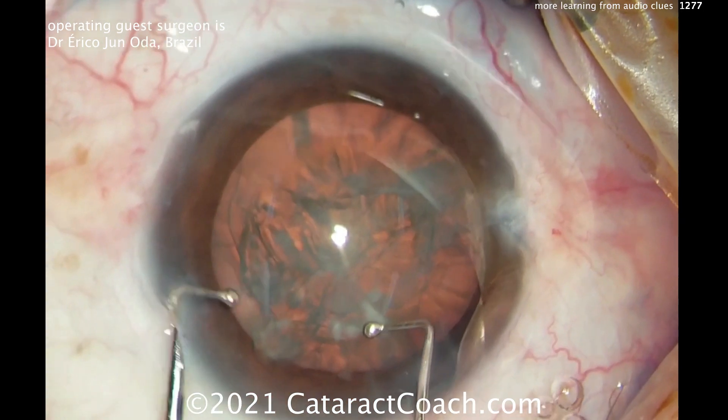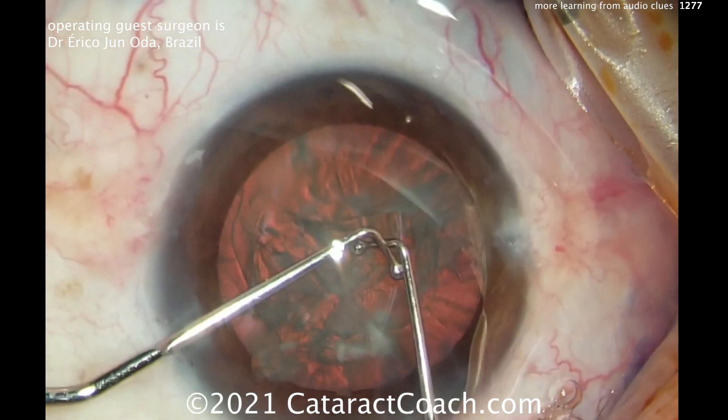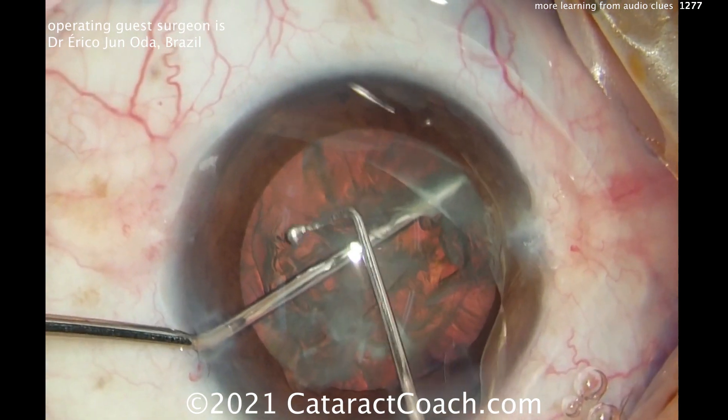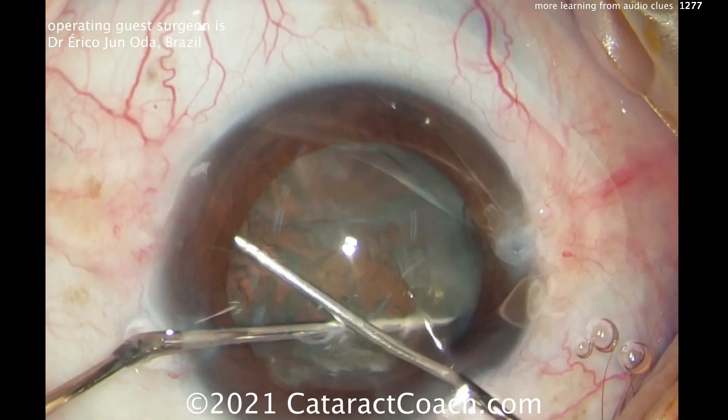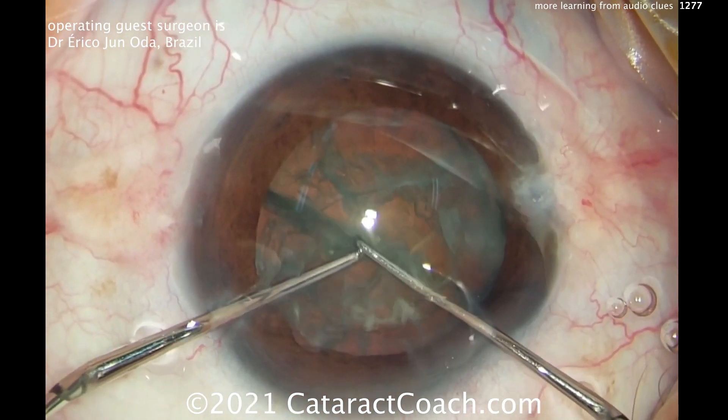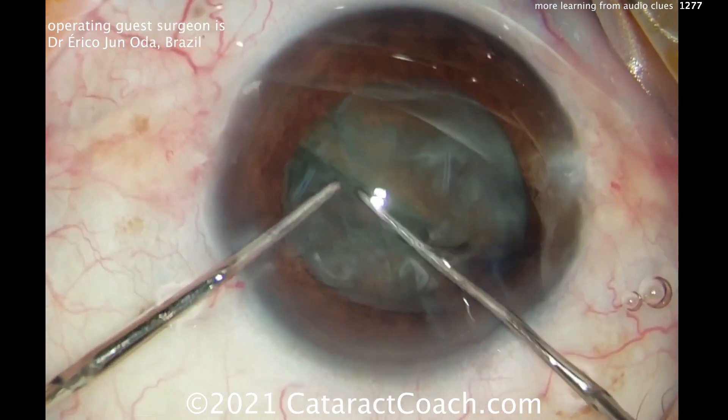Our guest here today is Dr. Ericko Junota from Brazil. You've seen his videos before where he uses these two choppers or these two hooks to basically split the nucleus into pieces. This is not a simple technique — you've got to be very careful in doing this. But he does split it very nicely here.